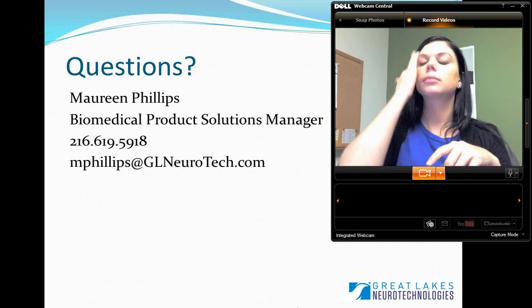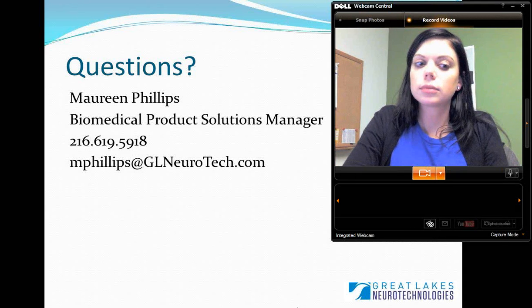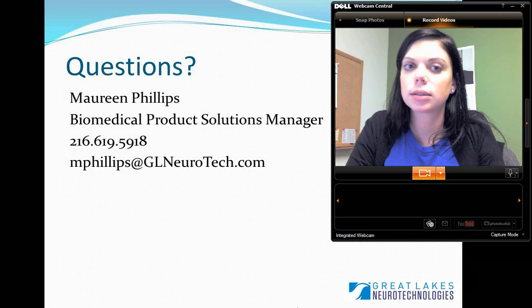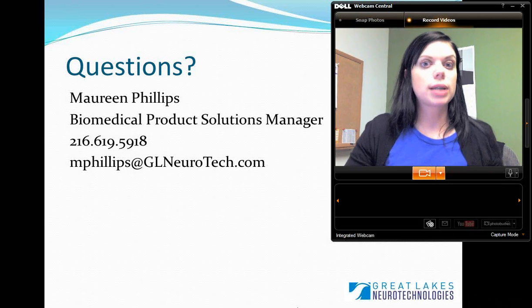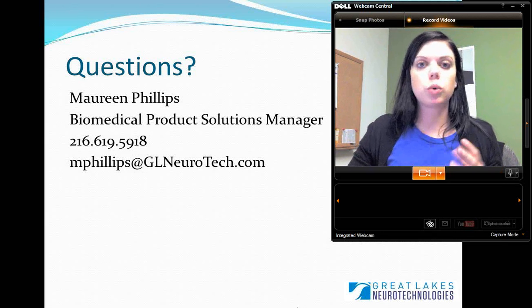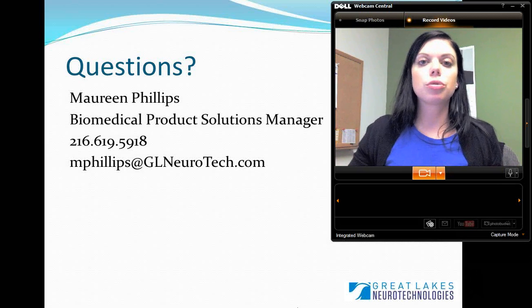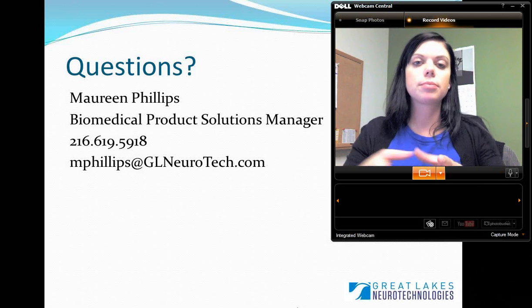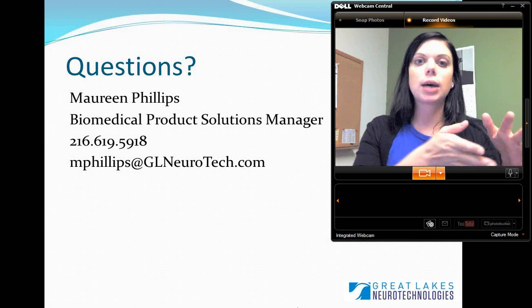Is LabVIEW part of your software? LabVIEW is not a part of the software directly. We just provide the integration between our device, or the data that you acquire with our software, and LabVIEW. So you would use it if you already have the LabVIEW programming language, essentially, because we don't provide the full package. It's the link between our system and LabVIEW.